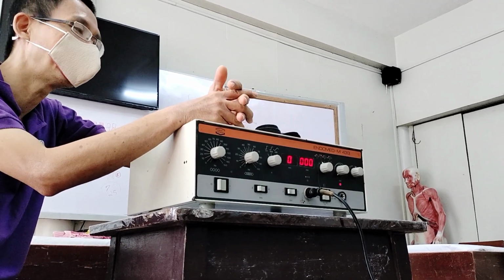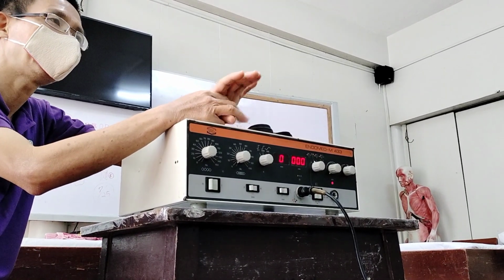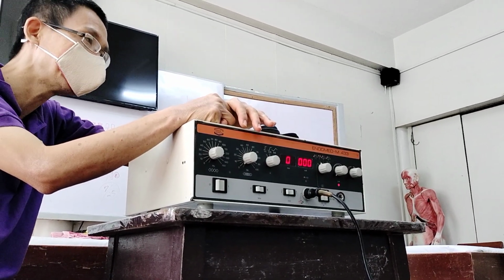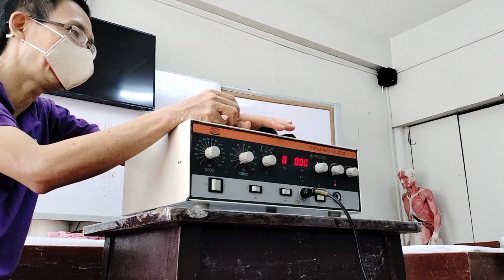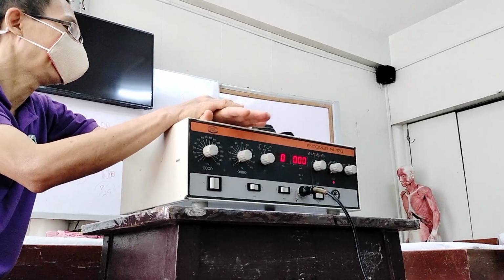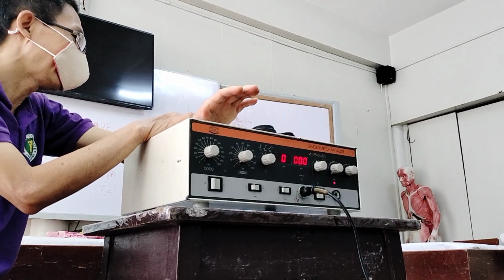So you have to be careful. There's a greater risk of encountering burns. As we mentioned in the lecture, there's greater strain on the skin under the electrodes in bipolar or two-pole. Okay?